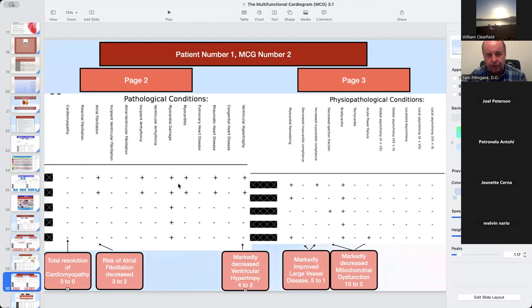Yes, this patient showed the same level of metabolic disease, but there was only 2 positive under myocarditis, only 3 positive under myocardial remodeling. The acuteness and chronicity of it didn't look as severe. When we look at the plaque that we saw under increase and decreased myocardial compliance, the levels went from 5 to 1, and the amount of plaque was decreasing. This person was reversing plaque, and that's wonderful. Then we want to know if this patient's congenital heart defect showed anything this time, and it didn't. It was a 1 out of 5 last time. It's a 0. So that confirmed my suspicions. It probably either wasn't real or wasn't important.